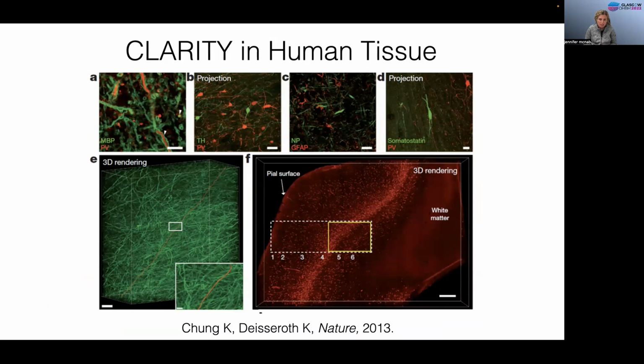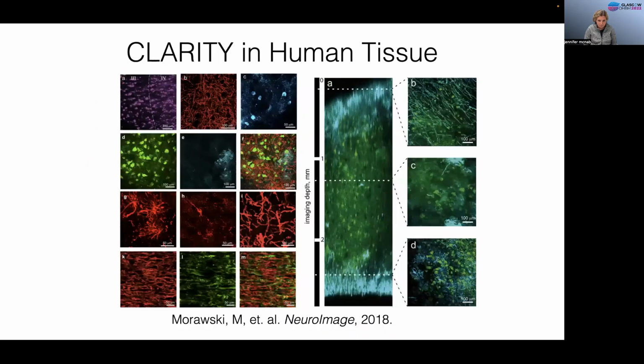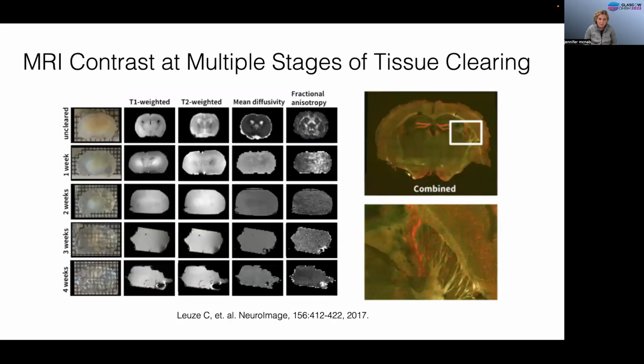Further, it's not possible to rely on transgenic labels, and many of the antibodies needed to visualize features of interest are quite large, and it's non-trivial to have them propagate evenly throughout the tissue cuboid. Still, Nicholas Weisskopf's group demonstrated the ability to use a number of different types of stains in cleared human brain tissue, and also the ability to stain fairly evenly over several millimeters of depth.